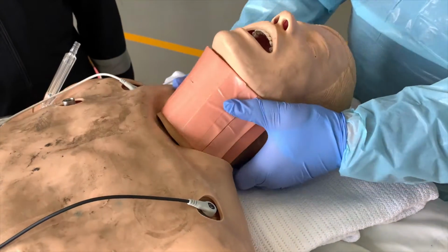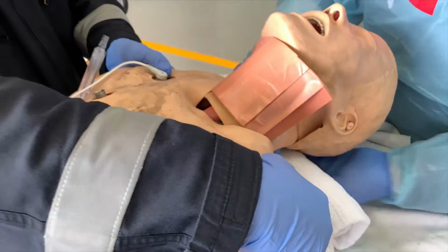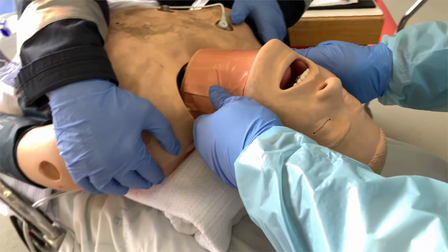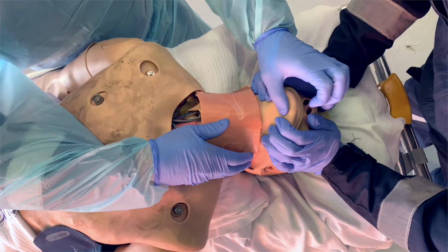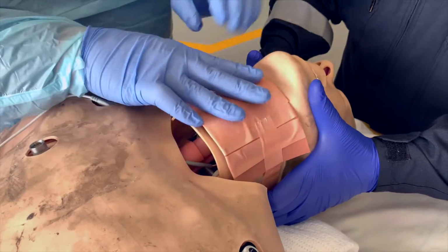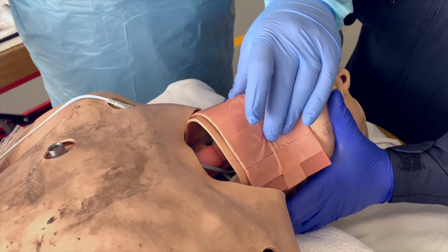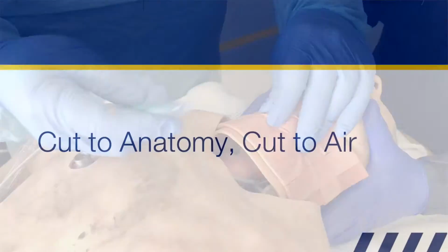Exposing the front of neck anatomy is an important step towards successful landmark identification. If possible, elevate the shoulders to encourage neck hyperextension. Also, tensioning the submandibular tissue will assist exposure of the anatomy. Consider using a team member to maintain hyperextension, or change the position of the patient, such as placing the head over the edge of the bed.